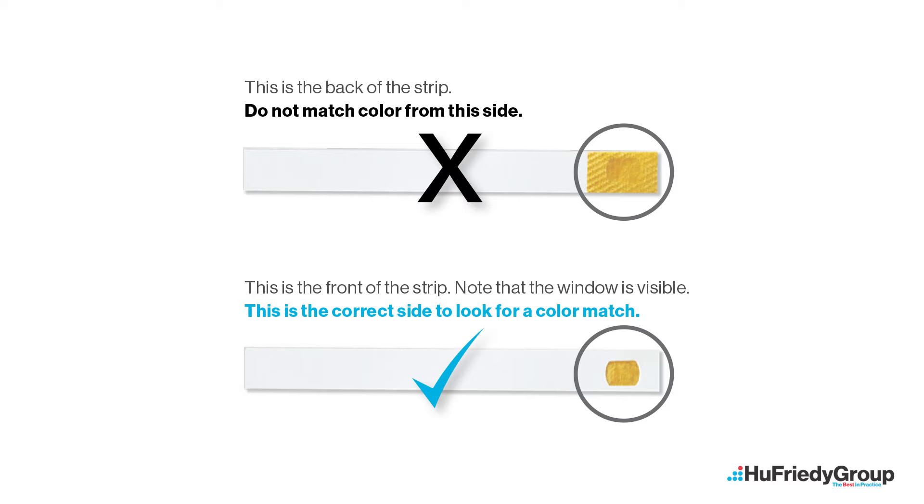Matching color from the back of the test strip instead of through the window may give you an unclear color match. Failure to reseal the bottle will cause the test strips to lose accuracy over time.